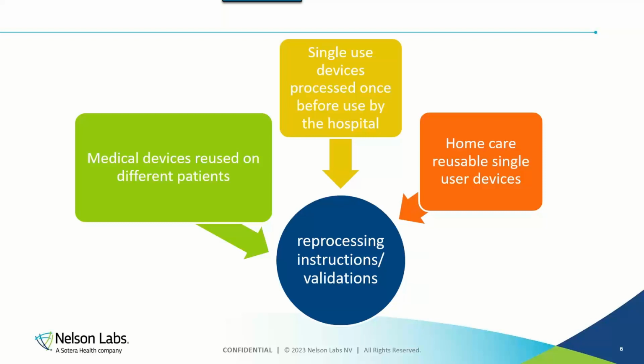The second category is actually single-use devices, but that are processed by the hospital once before use. So the hospital is going to clean and sterilize them, for example, once before they use the device.